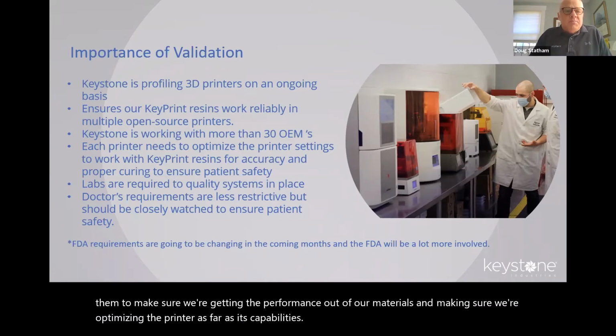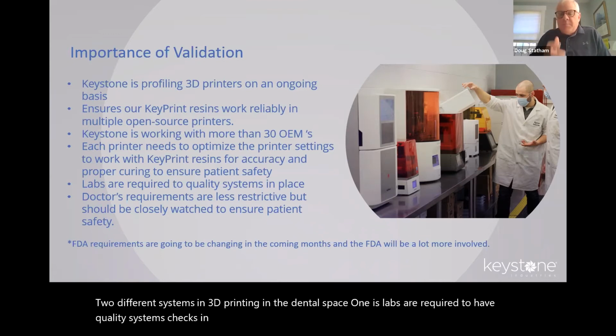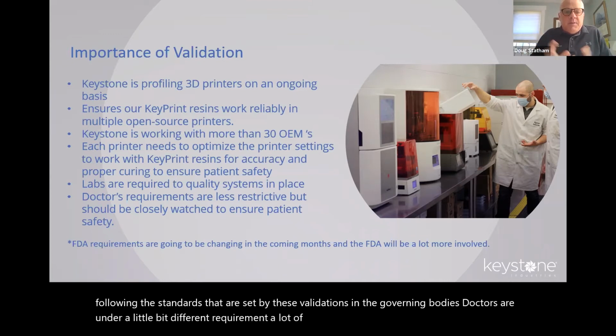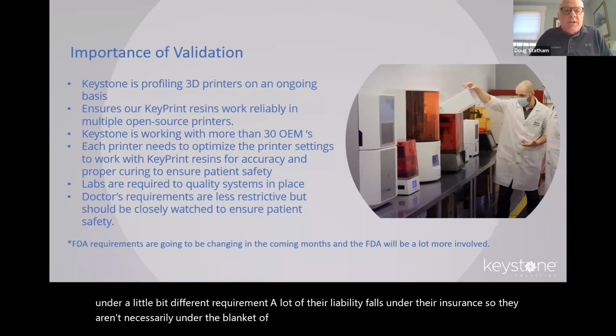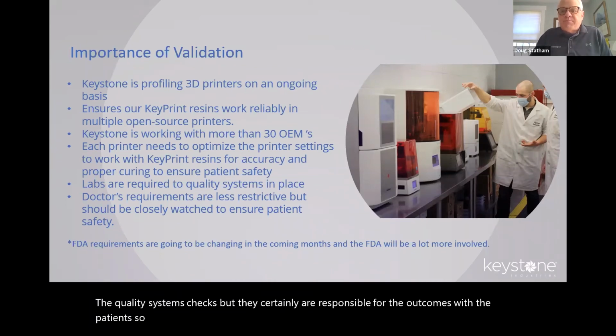There are two different systems in 3D printing in the dental space. One is that labs are required to have quality systems checks in place. That's why it's so important to make sure that you're following the standards that are set by these validations and the governing bodies. Doctors are under a little bit different requirement. A lot of their liability falls under their insurance. So they aren't necessarily under the blanket of the quality systems checks, but they certainly are responsible for the outcomes with the patient. So they rely on these a lot too if they are doing any in-house printing.